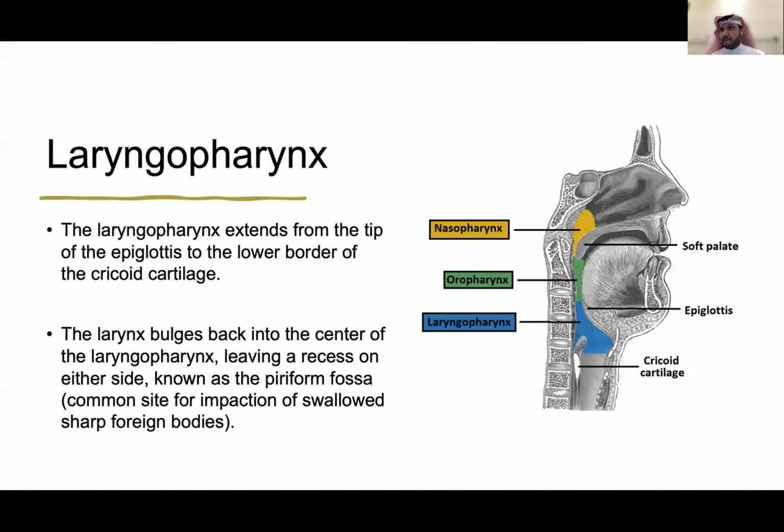And the infant airway is narrow, and the adult, as we said, is broad. An infant or child is soft and in a more horizontal position, and that's why we like to use the straight laryngoscope, not the curved. The straight laryngoscope blade facilitates lifting the epiglottis, because our challenge when we go inside the airway is the epiglottis, so we prefer the straight laryngoscope. In adults or older children, we can use the curved one, because you can go behind the epiglottis and easily elevate it and go inside.